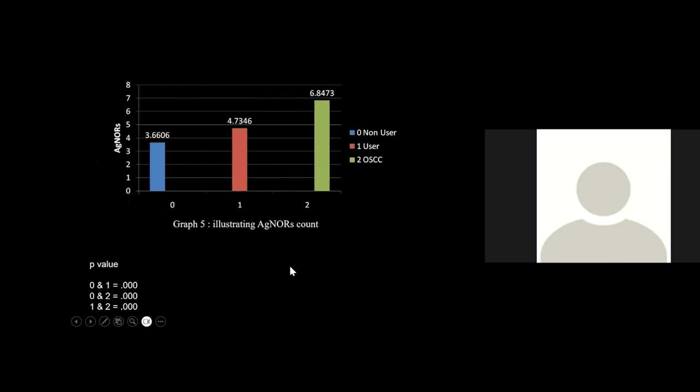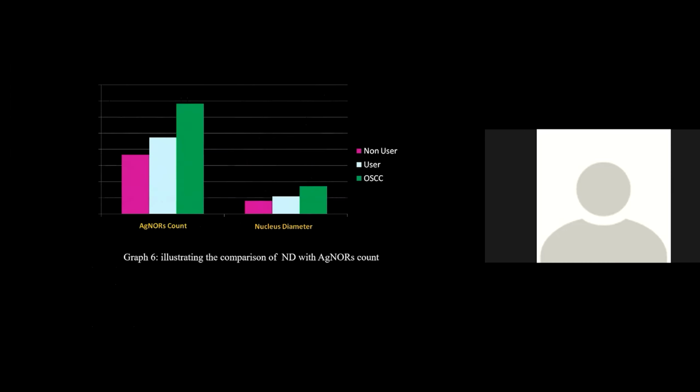Okay, and we can also appreciate the increasing nucleolar count. Next. So again, we can compare the nucleolar count and nucleus diameter, which are increasing in oral squamous cell carcinoma patients.